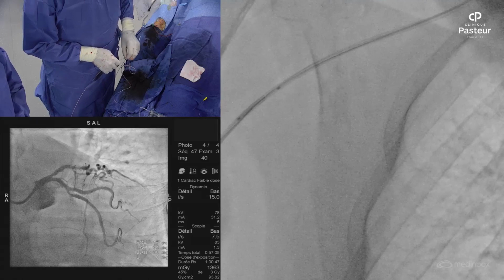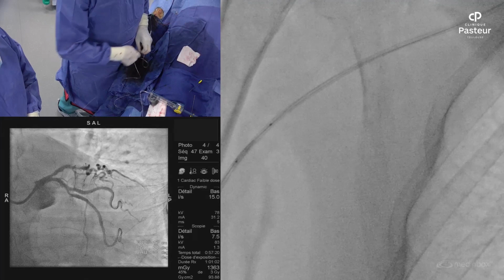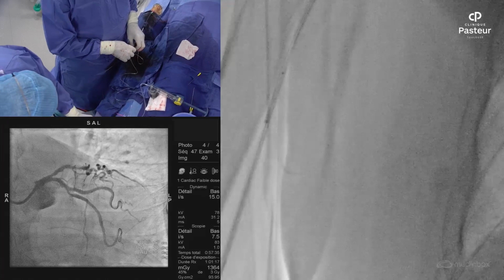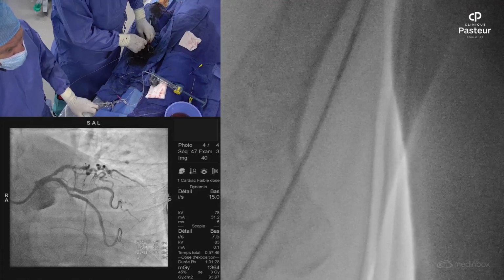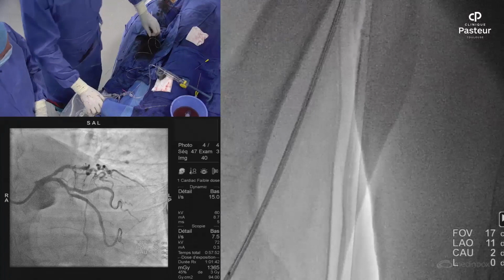Okay, here we are now. I think so. Good, and this one we have to remove as well. You see, the stent is going down. Yeah, but I cannot remove it. Okay, here, you have to accompany the arm. It will be difficult if we have to move the table. Go ahead. Okay. Perfect. Thank you. Good. We continue. Okay. Here, we have it, we don't have it, we dropped it. I cannot see it. No. The stent is here. Yeah. Okay. We continue here.